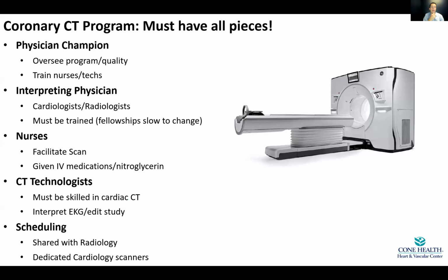So how do you scale up, or how do you start a program? I always say coronary CTA is not just a scanner, it is a program. These are the key components that I see that are needed. You're going to need a physician champion to oversee that work, trained nurses and technologists. You're going to have a good reader pool of cardiologists and radiologists. I think fellowships have been slow to train in this, but that's rapidly changing.